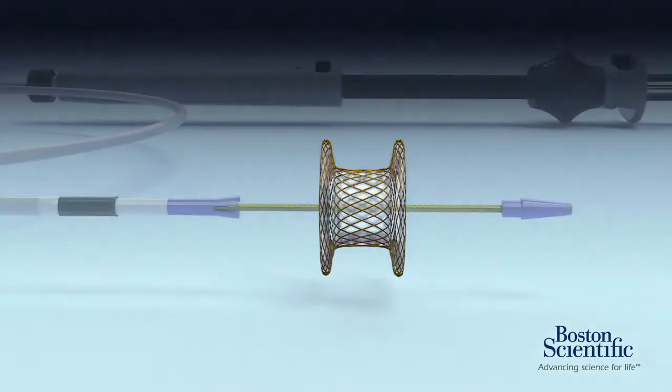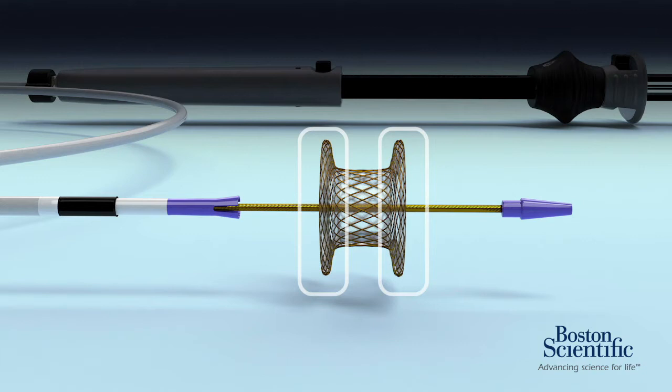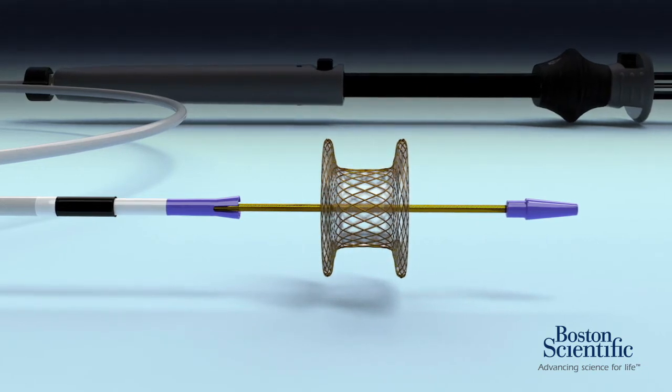Its dual anchor design prevents migration and maintains tissue apposition. The Axio Stent is fully covered to prevent leakage of fluid, resist tissue ingrowth and enable ease of removal.